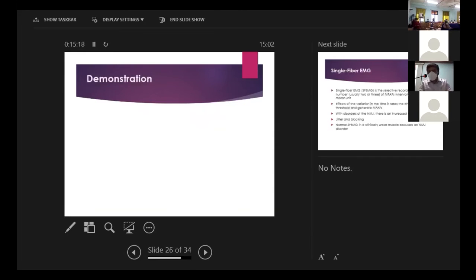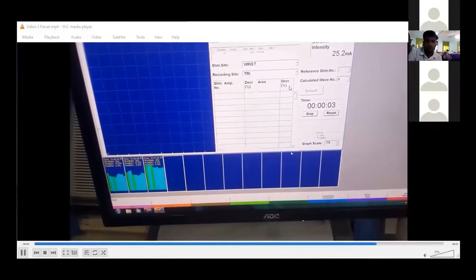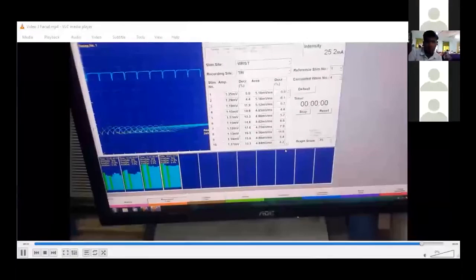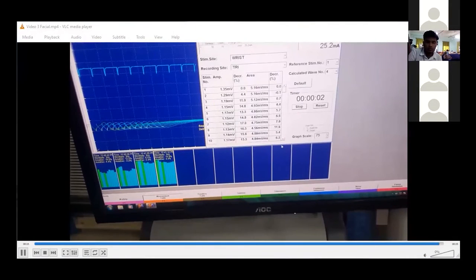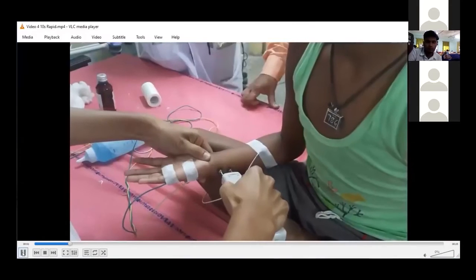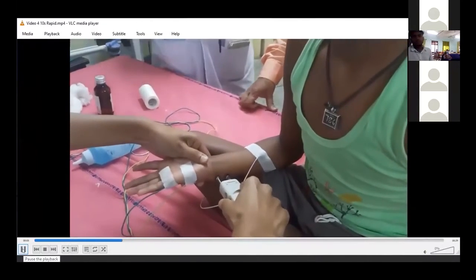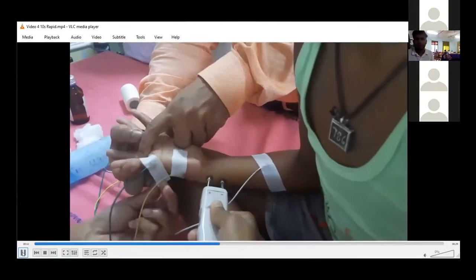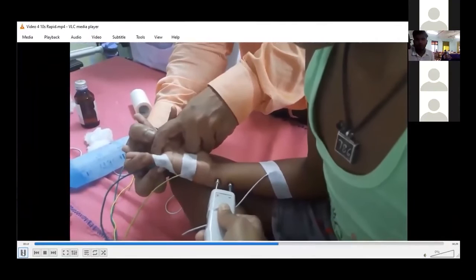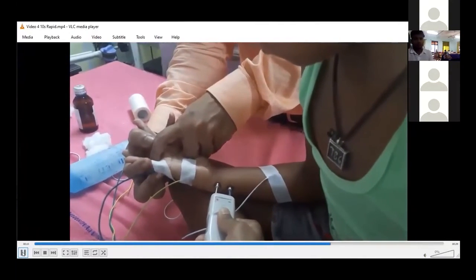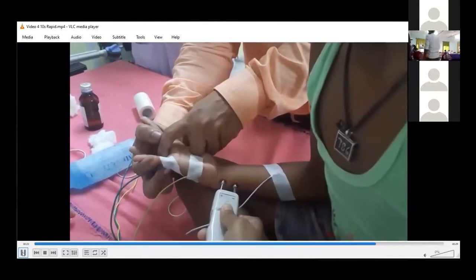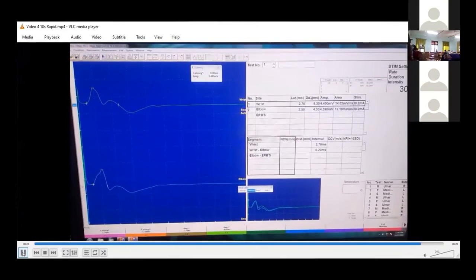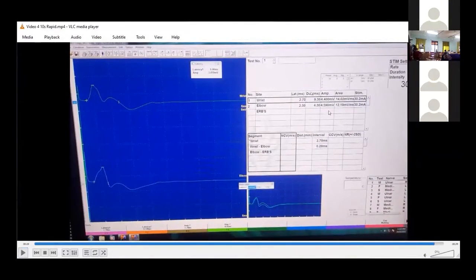Video demonstration: the last video shows the substitution for rapid RNS. A baseline CMAP is obtained, then after 10 seconds of maximal voluntary exercise, another CMAP is recorded and the two are compared. This maximal voluntary exercise at 10 seconds can substitute for rapid RNS; in the demonstration, any increment seen is not significant.